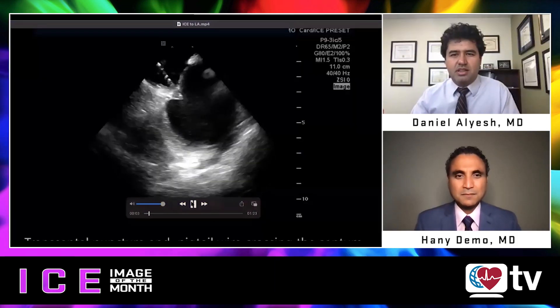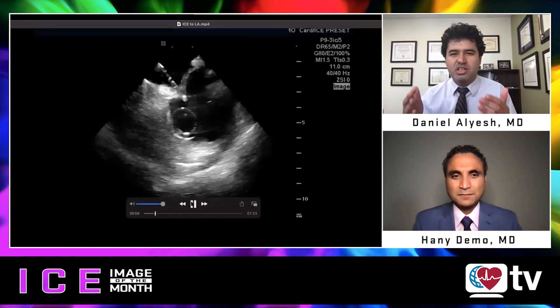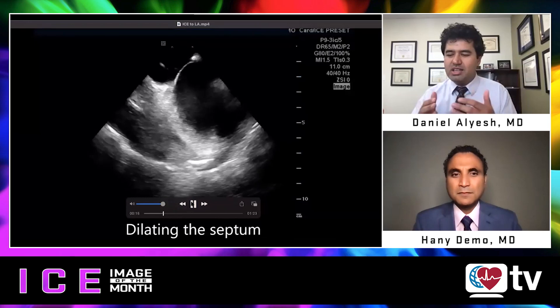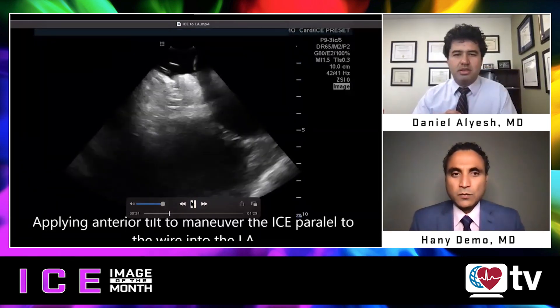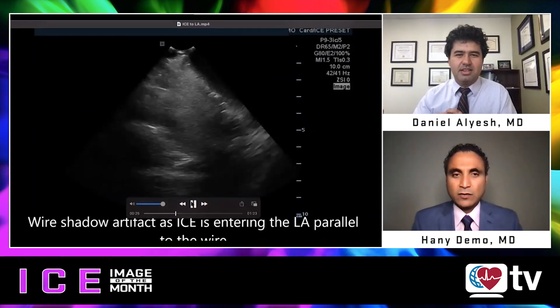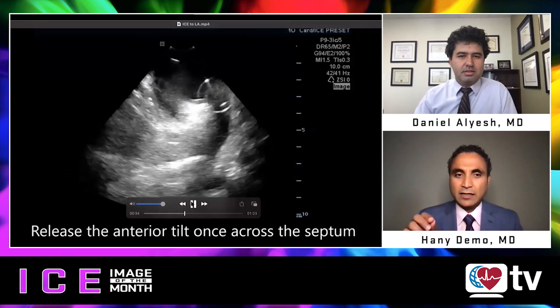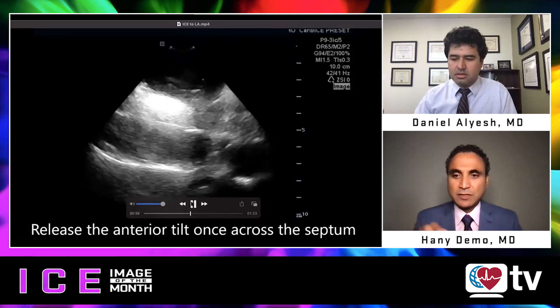So this is our first image we'd like to discuss — thank you very much for a great image. In this video, you show your transeptal puncture as well as putting the ICE catheter into the left atrium without fluoroscopy. Would you mind walking us through the steps for doing this? So once I performed a transeptal puncture and I have my wire across, I dilate the septum with the dilator on the sheath, and then I pull the dilator back into the right atrium, leaving only the transeptal wire.